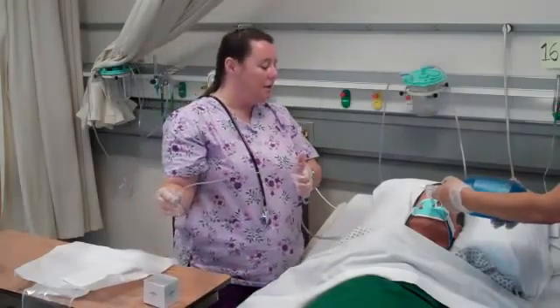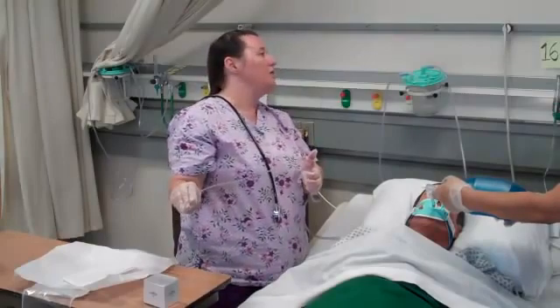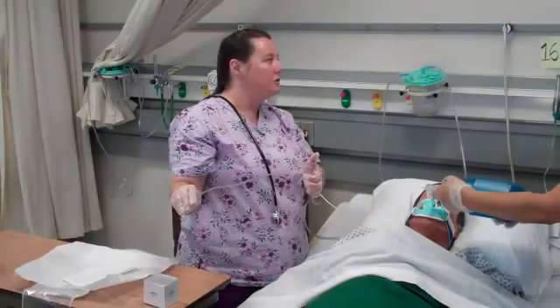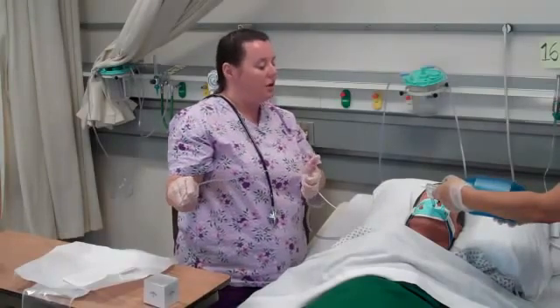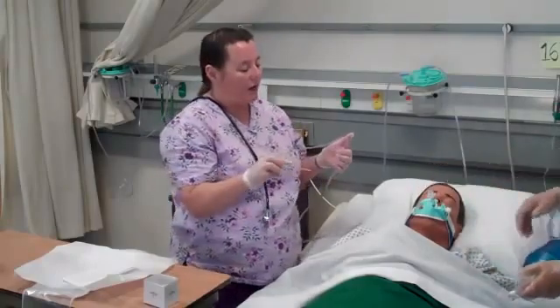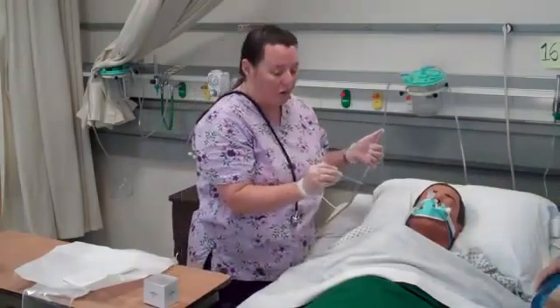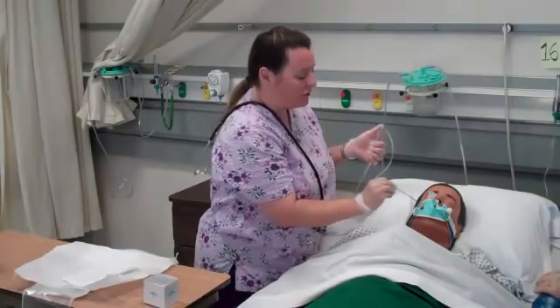I reassess my patient. He appears to be breathing easier with less agitation. Looking at the monitor, his O2 sat has returned to baseline and his heart rate is back to baseline as well. The patient can now be placed back on the ventilator. I also want to assess his oral mucosa to see if it warrants suctioning of saliva and secretions.